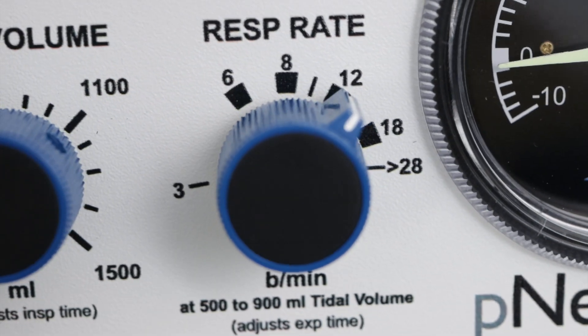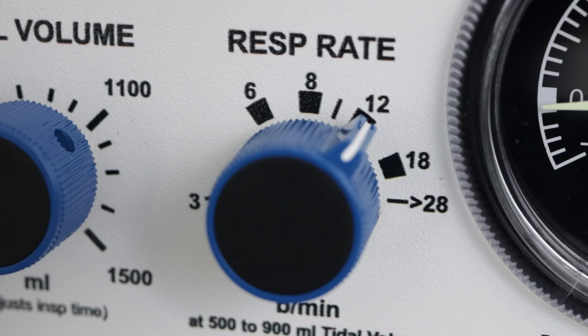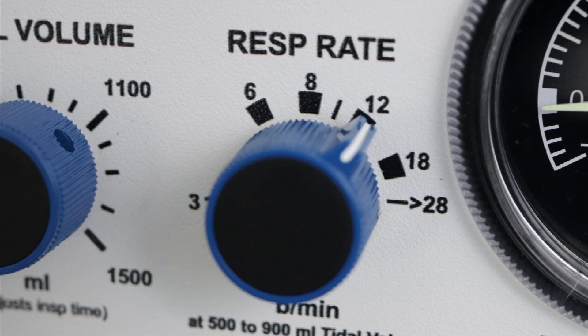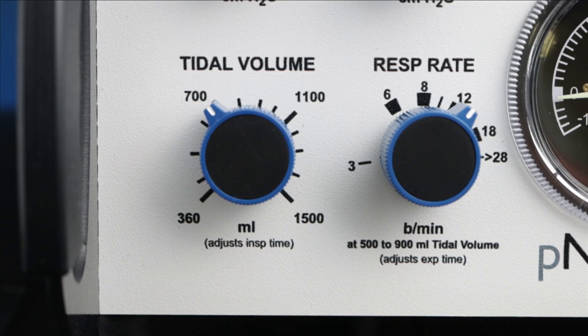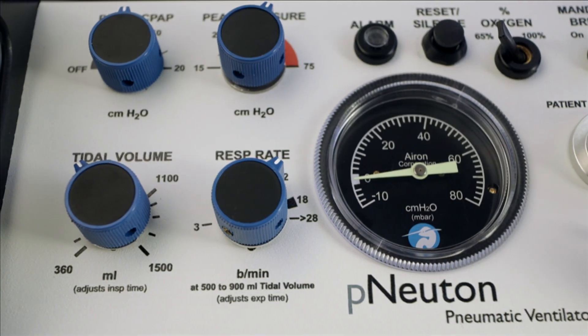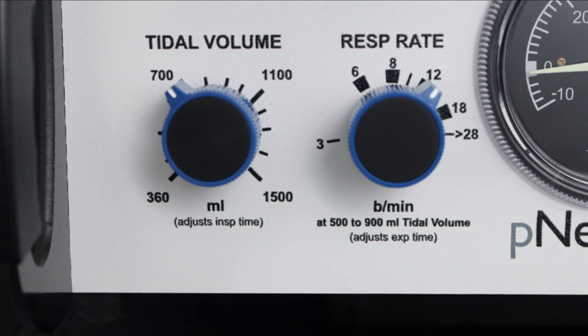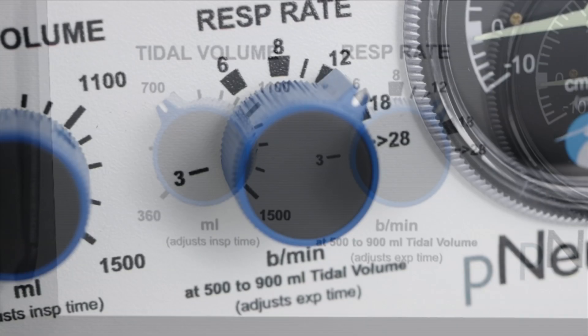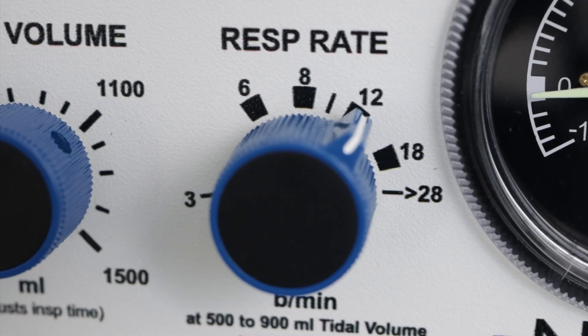Respiratory Rate Control. To the right of the tidal volume is the Respiratory Rate Control. It accommodates a patient mandatory breath rate in a range of 3 to greater than 28 breaths per minute. There is a wide range setting at lower respiratory rates to provide better control for slower intermittent mandatory ventilation or IMV rates. Additionally, the respiratory rate can provide a maximum rate of 50 breaths per minute depending on the selection of tidal volume. As a pneumatic ventilator with a peak flow that remains constant, when you change the tidal volume the inspiratory time changes. It is recommended that you set tidal volume first and then your desired respiratory rate. Changing respiratory rate changes expiratory time. For further information, please refer to the User Manual, Section 4, Operating Instructions.